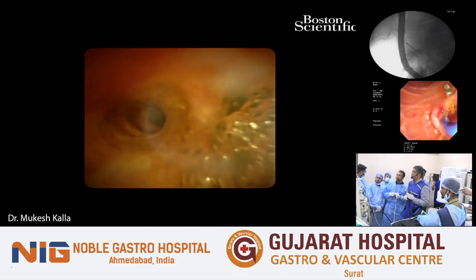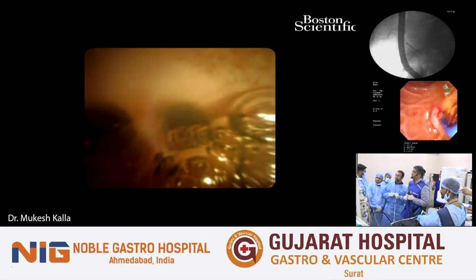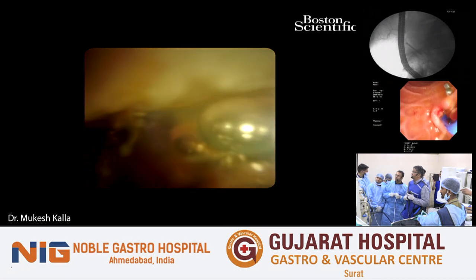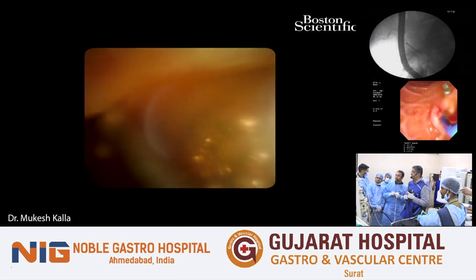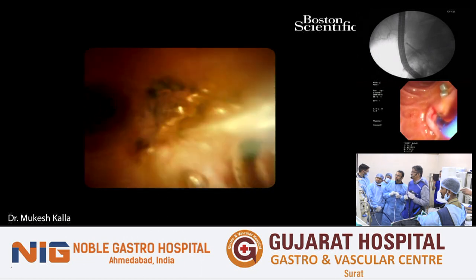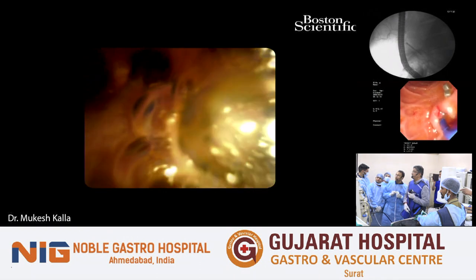There were small stones in the common bile duct earlier, which we have already removed. So the aim now is to explore the location of the cystic duct, go inside the cystic duct and see if there are remnant stones. We will try and bring them out as well.